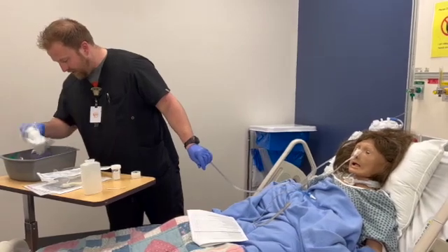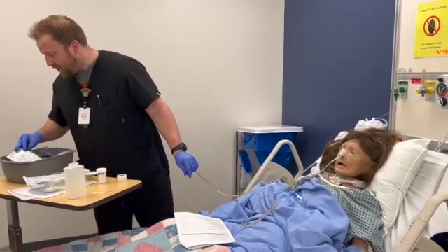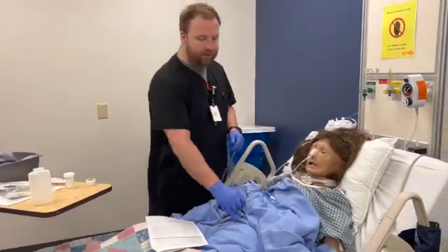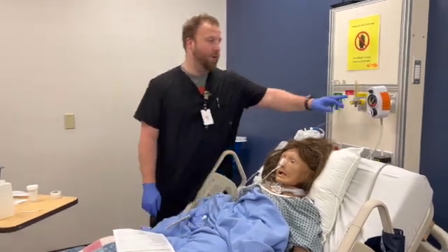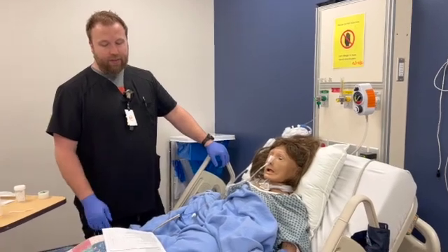I don't know that this kit has a little device, but it's a little device. The suction will connect to this tubing, and you'll make sure it's on low and intermittent. And that'll be for that one.